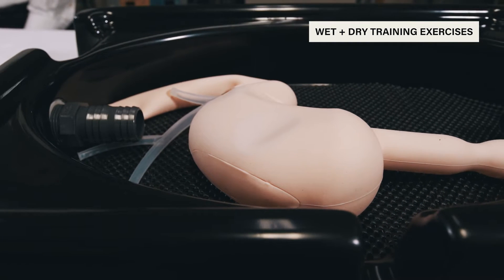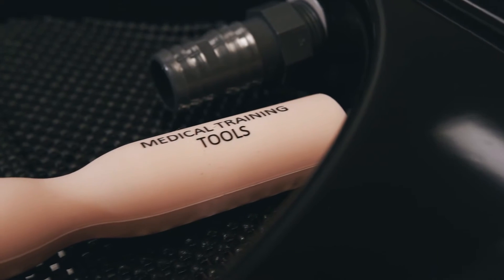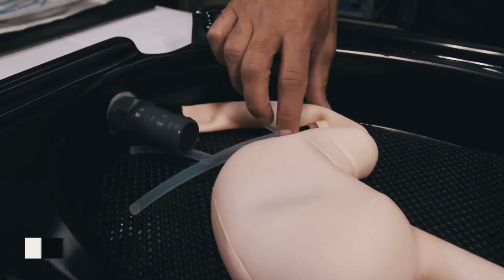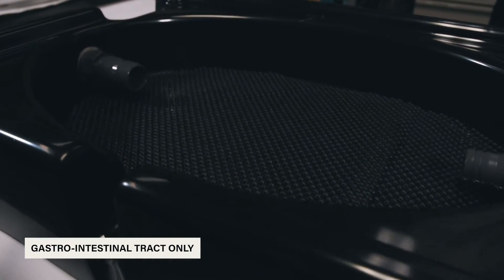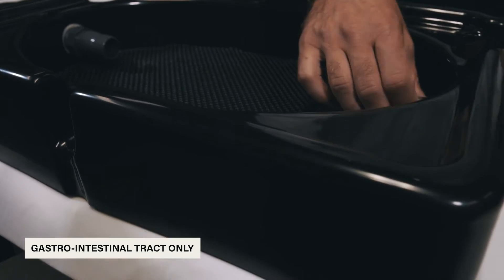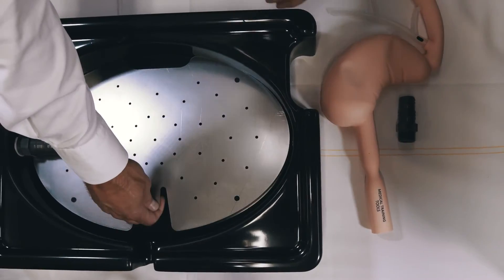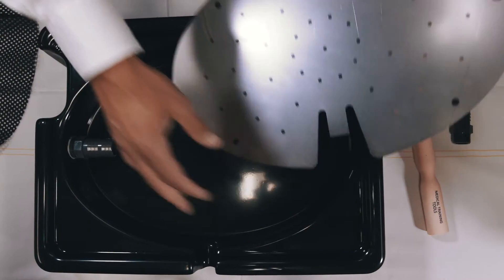Various silicone anatomical models are designed to be attached to the TD Box. These models are streamlined to focus solely on the gastrointestinal tract, thereby clarifying the basics of practical training. The TD Box and silicone simulation models usher in a new era of user-friendly training for flexible endoscopes.